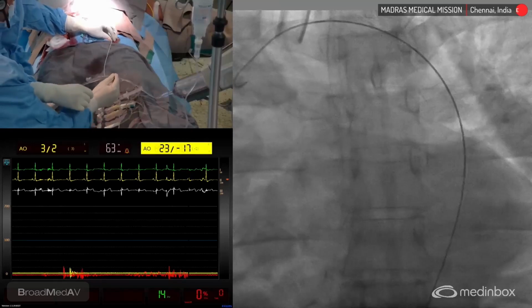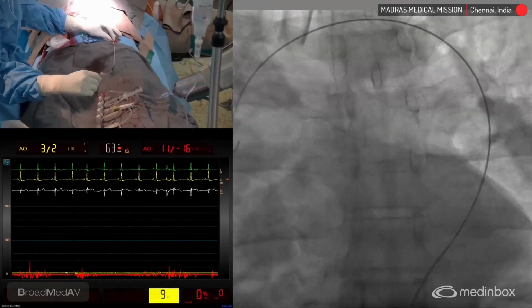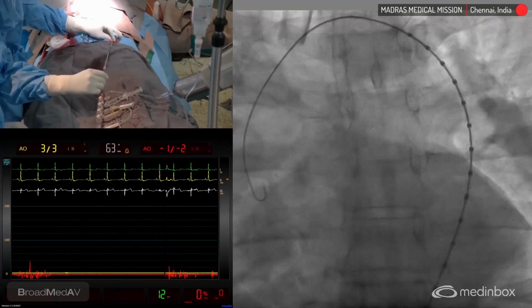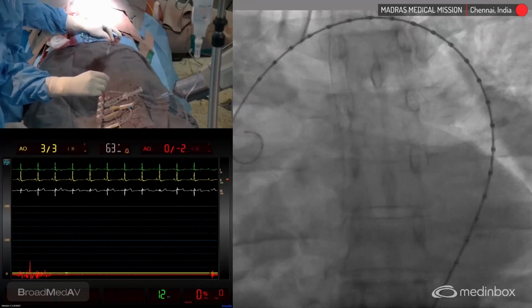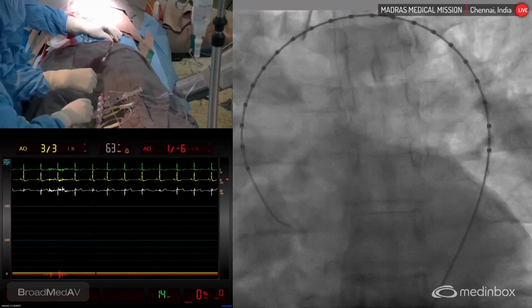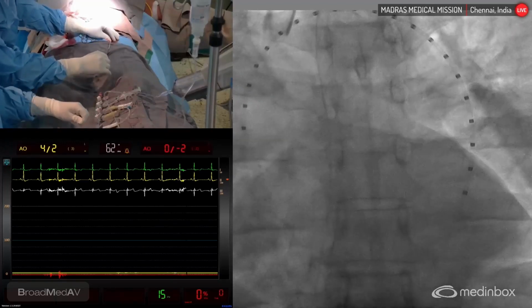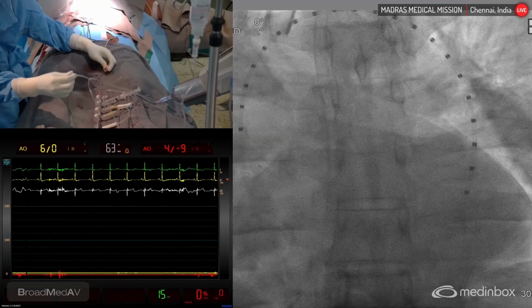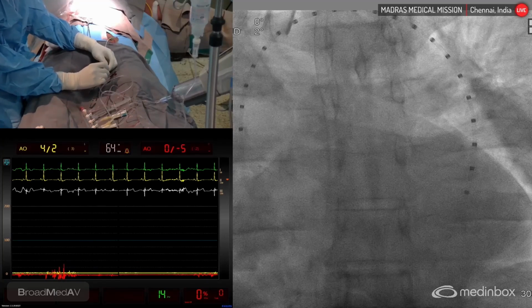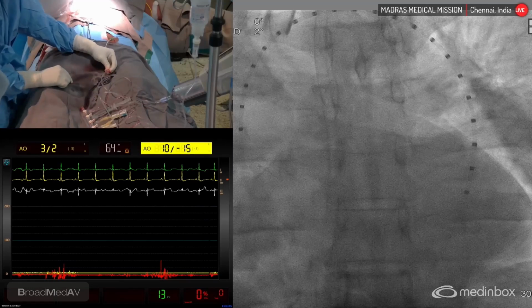Every time as we are going, we need to be careful we are not entering the aneurysm sac. Here the aneurysm sac is thrombosed. Sometimes it may have a space where our catheter can go and disrupt the aneurysm. If that happens, you'll have embolization to both legs and you'll have purple toe syndrome. So the manipulation of the wire and catheter in the aneurysm should be done carefully.